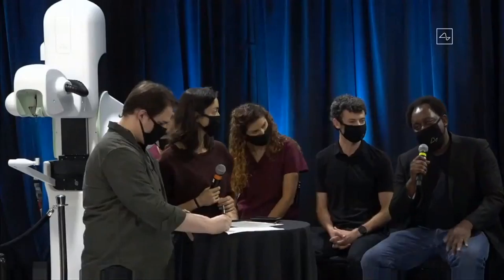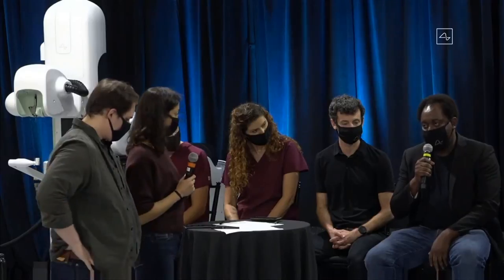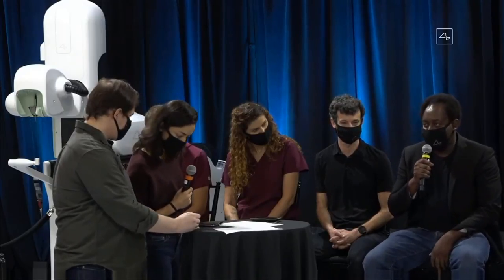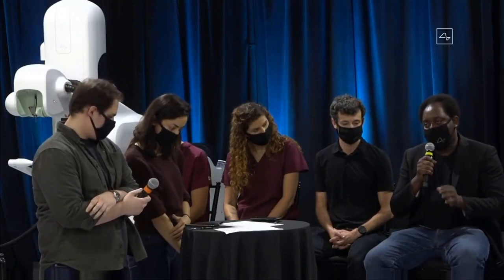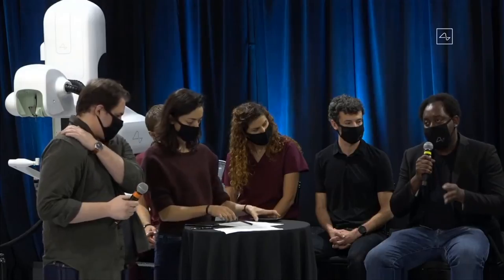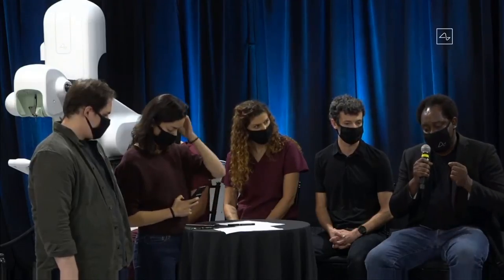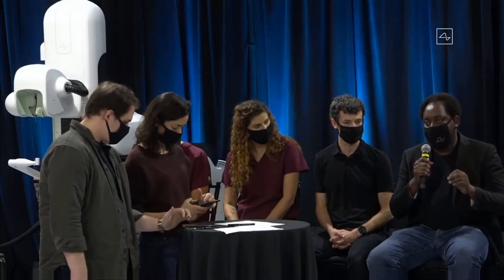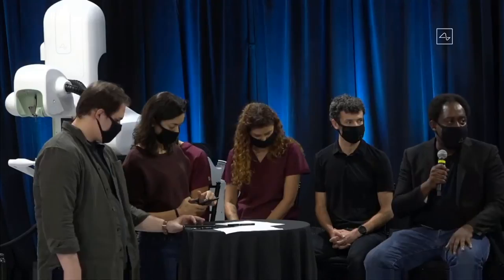Also, do you want to introduce yourself? I'm Felix Deku. I currently lead the microfabrication team. My team is made up of a group of process engineers and material scientists. Our job is to make the tiny wires, as Elon referred to them, what we call the threads that are implanted in the brain. Of course, the threads are made of conductors and insulators, and choosing the right material that is amenable and compatible to the brain is something our team has expertise in. We work seriously on interface engineering to make sure that our layers are well thought through and well designed, so that at the end of the day, when we implant this device, it will be functional for either reading or writing in the brain.